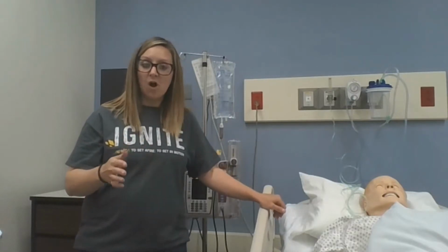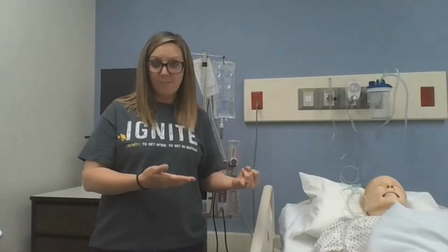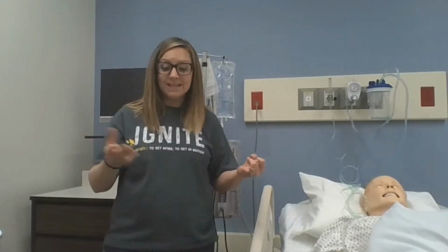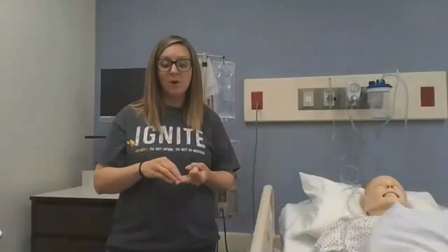There are a couple of different options on PCA pumps. You can do continuous infusion only, which is what we would use in the circumstance of an end-of-life or hospice type patient, so that they're continuously getting the narcotic without having to do any work or hit the button to get it. There's a PCA dose plus continuous, which means that they are getting a constant basal rate of the medication, and then they would hit their button to get an extra bolus dose as well.